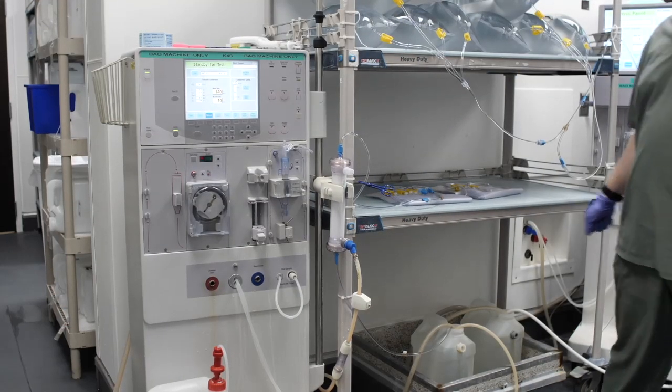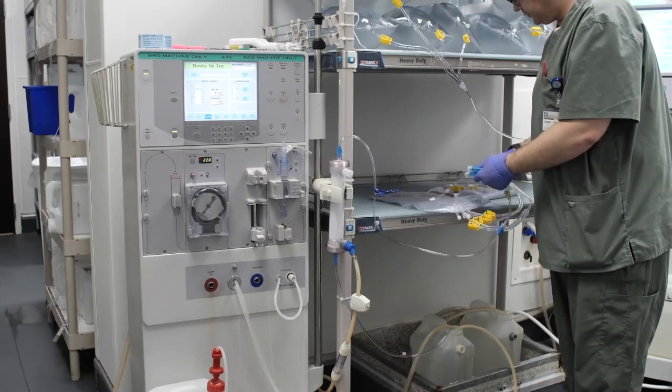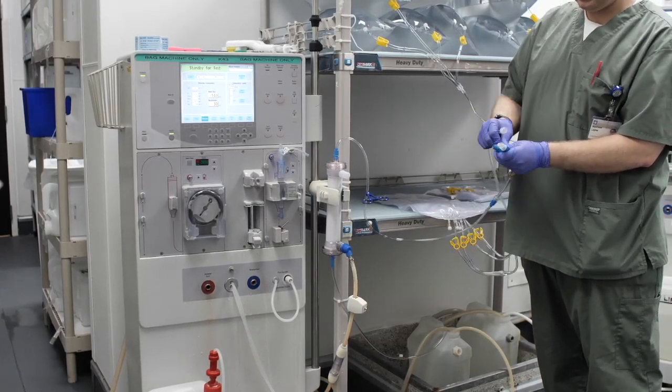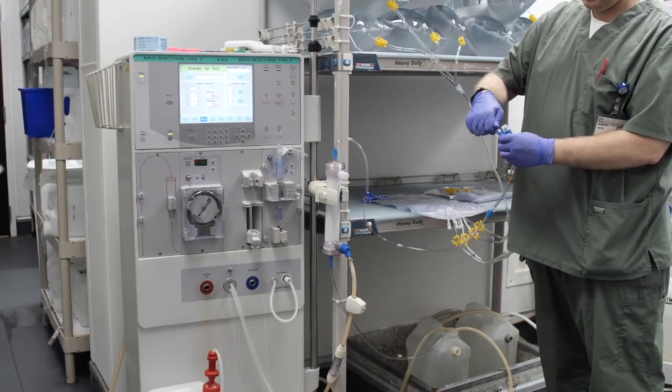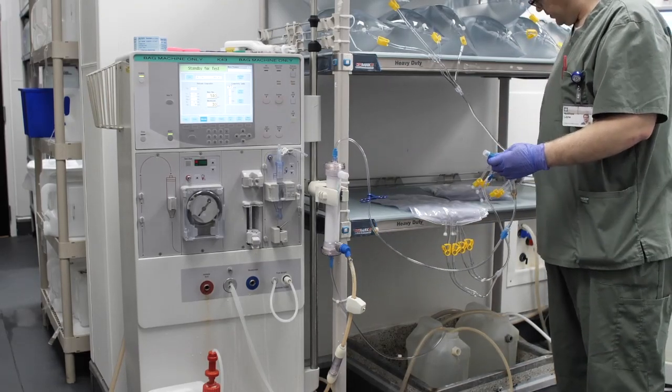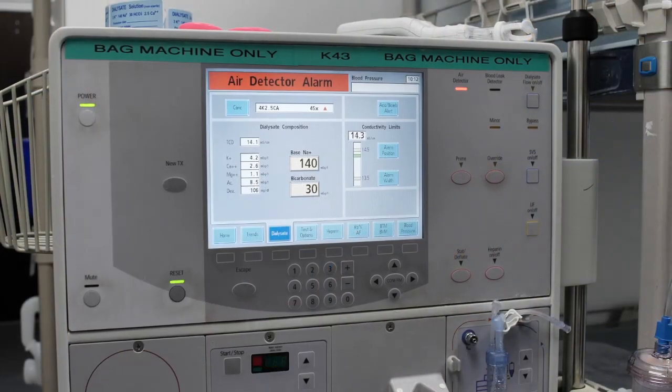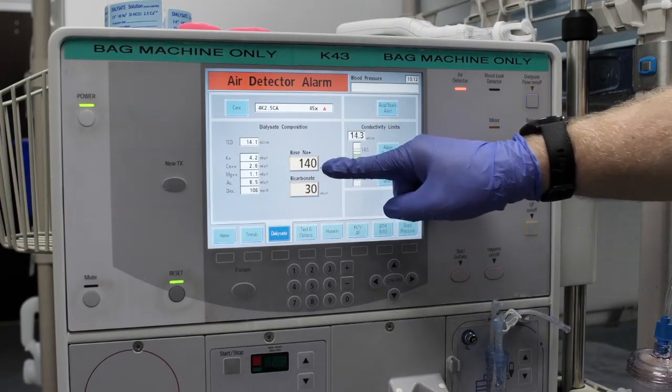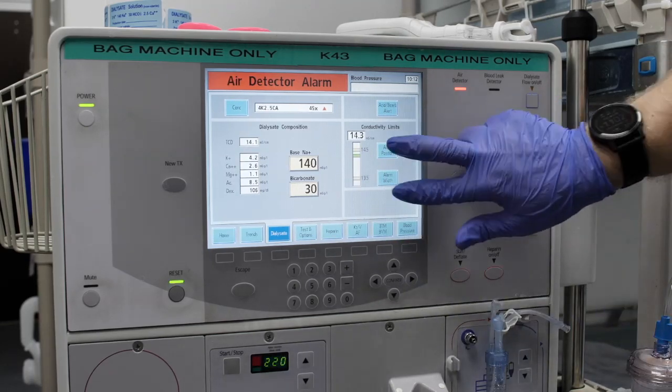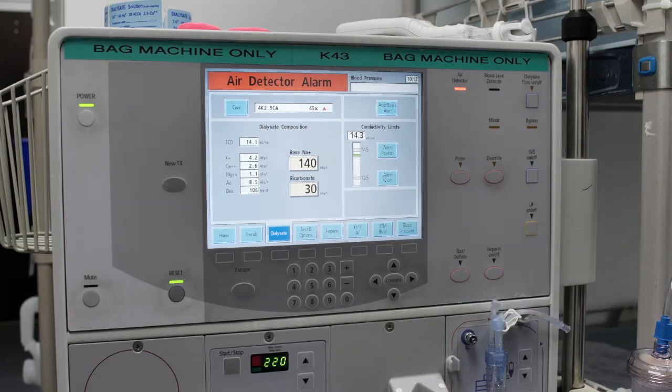Step 13: When ready to begin production, using aseptic technique, attach two four-bag Liberty drain bag sets to the two capped ends of the splitter line. Step 14: Ensure the machine is set to the proper dialysate settings, the proper acid concentrate solution is connected, and the machine is operating in the appropriate conductivity range.